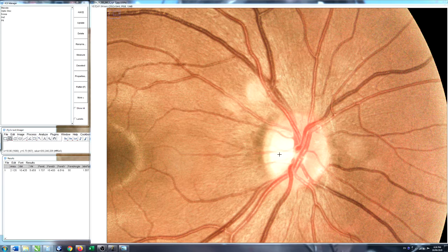These structures are of clinical interest because if you get high pressure in the eye — for example during glaucoma — that pressure will push down on the optic cup and make it larger, changing its shape. So you can usually diagnose increased ocular pressure in part by looking at these structures.